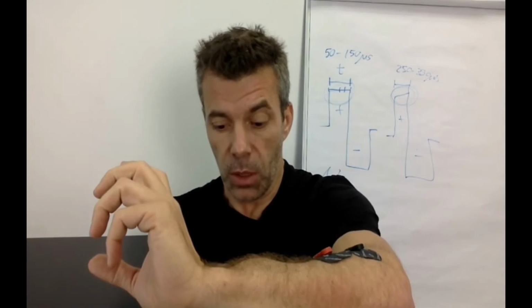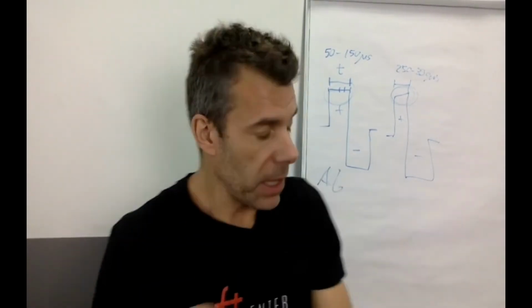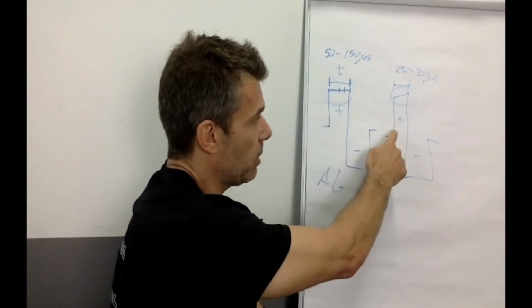I'm stimulating the alpha motor neuron, and in this case, that would be counterproductive because I'm working a muscle that I actually want to relax, give it a pain relief program or something like that. I'm lowering the intensity so it doesn't bother me. All right, so you've seen it now. If you go overboard with the intensity, you're going to end up stimulating this type of fiber, which you don't want in a pain relief program.